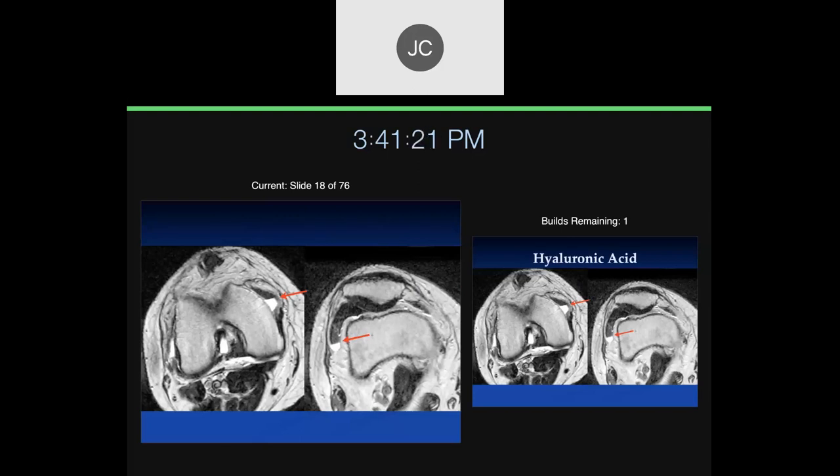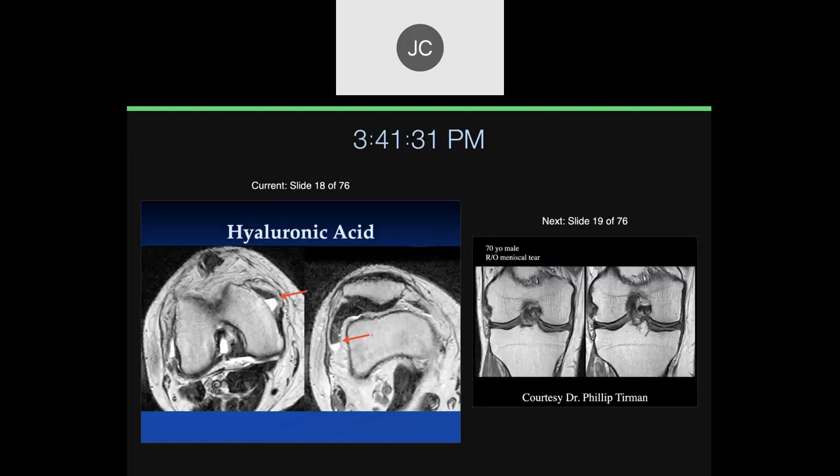You've got two different kinds of fluids here. The top one is low signal and the bottom one is bright on T2. This is someone who just had a hyaluronic acid injection. The hyaluronic acid is floating on top, and there's a lot of dephasing in the signal so we don't get signal there. Regular fluid on the bottom is bright. This patient was scanned right after they had a knee injection.